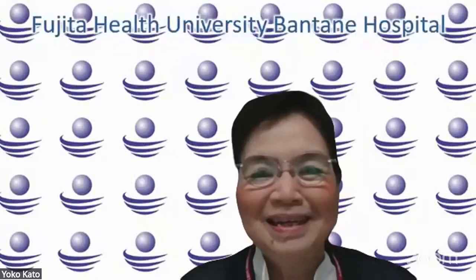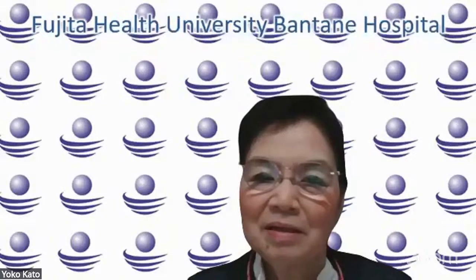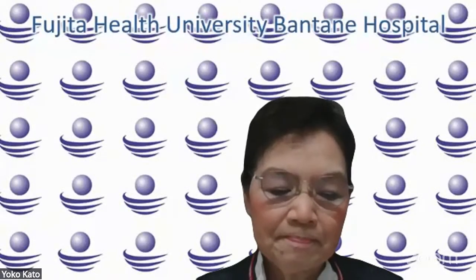Thank you very much. You can invite comments from Prof. Kato. No, it's okay, fine. So I think it's quite new for me, because coil plus liquid material. So Tsuruta sensei, is it kind of popular in Japan? Yeah, not popular. We are aware of migration of embolic material causing distal embolic complication. So usually we don't do it. And in my experience, coil embolization with the sandwich technique is usually enough.